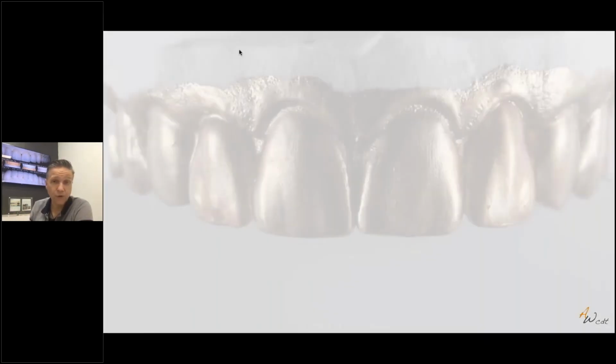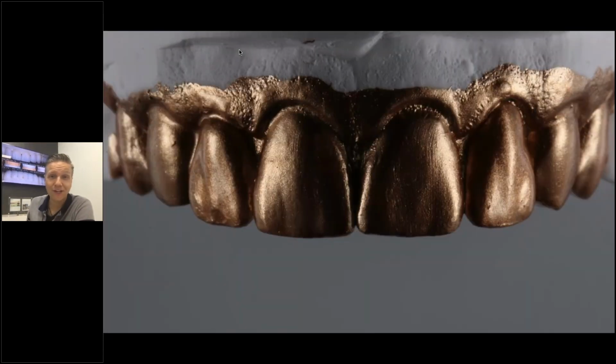Usually I would ask who can spot the crown or the veneer, but you guys can write down an answer so fast, I'll just tell you. Number 10 is a veneer, and everything else is natural dentition. And I utilize these powders or lacquers basically just to avoid being disturbed by different colors like stone or ceramic in the anatomy, to match it perfectly to my anatomy and texture, and then I can remove the color and take care of finishing the crown or the veneer.